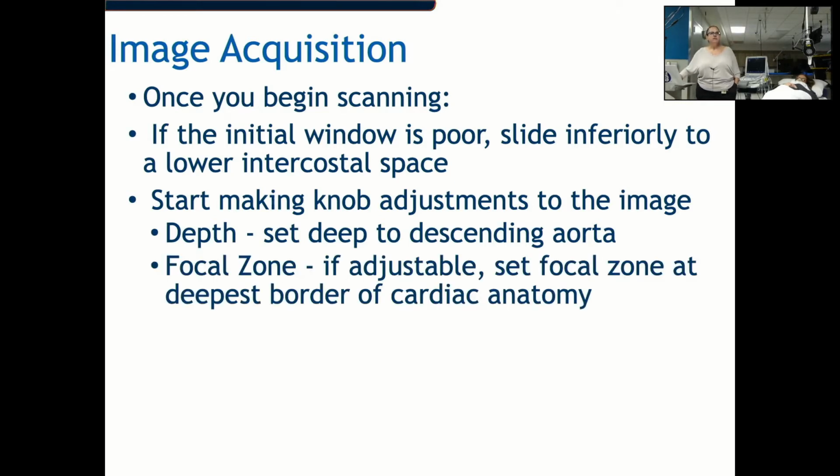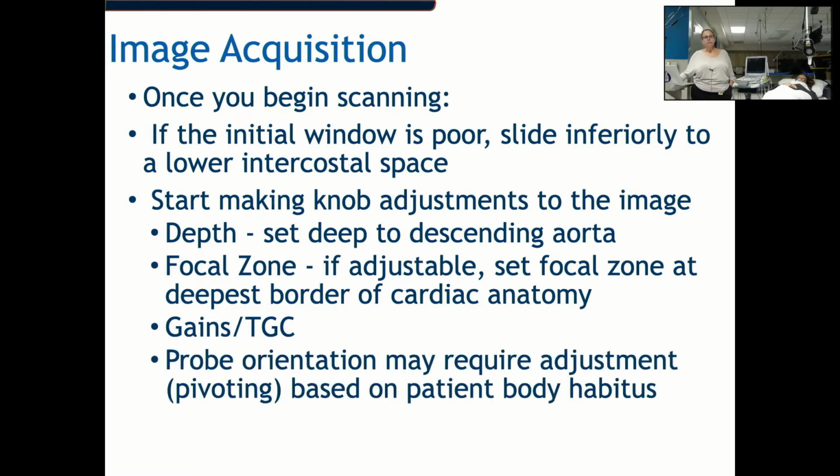You would set your focal zone if it's adjustable on your system. If so, your focal zone always is set to the deepest border of the anatomy of interest. And then you're going to set your gains and your TGC.